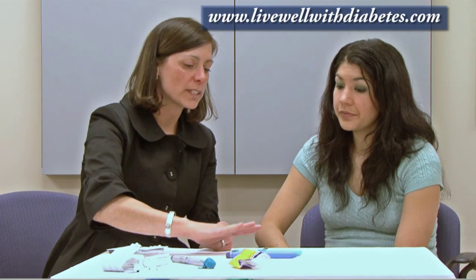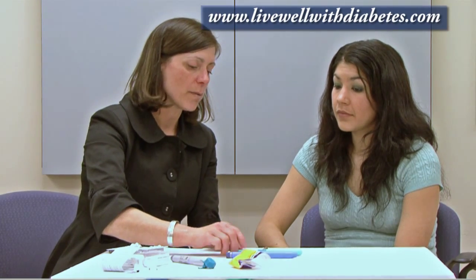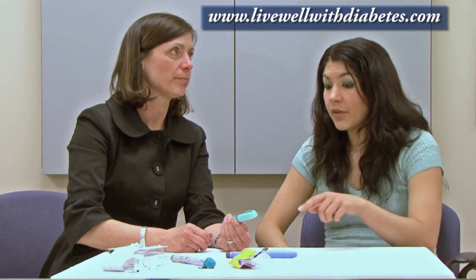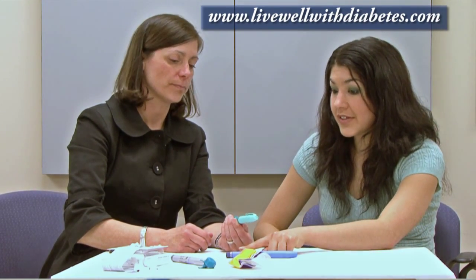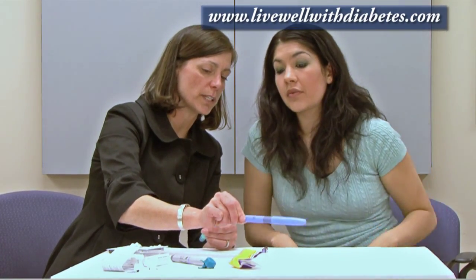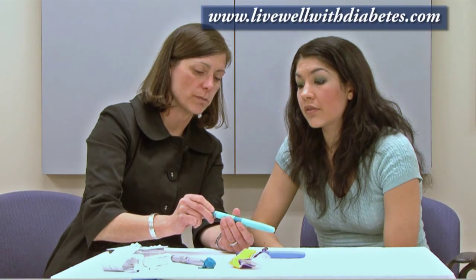They're both exactly the same in how you use them, but I'll just choose this pen here and show you how this one is used. The one that dials by two is at a higher dosage — that's right, this one goes to 42 units and this one goes to 21.